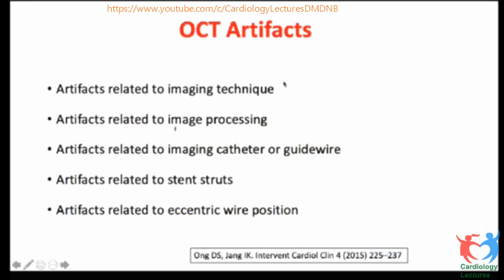And moving on to OCT artifacts. OCT artifacts are divided into five types. One is artifacts related to imaging techniques. Second one is artifacts related to image processing. Third one, artifacts related to imaging catheter or guide wire. Fourth one, artifacts related to stent struts. And the last one is artifacts related to position.